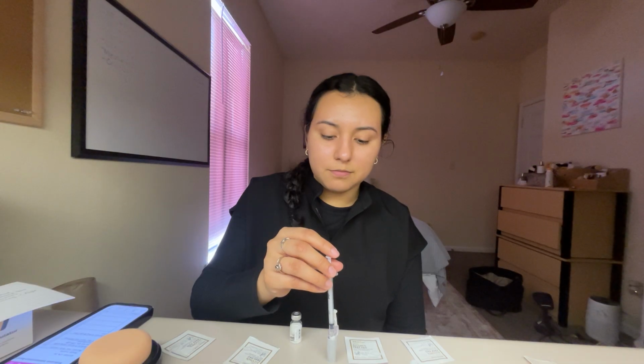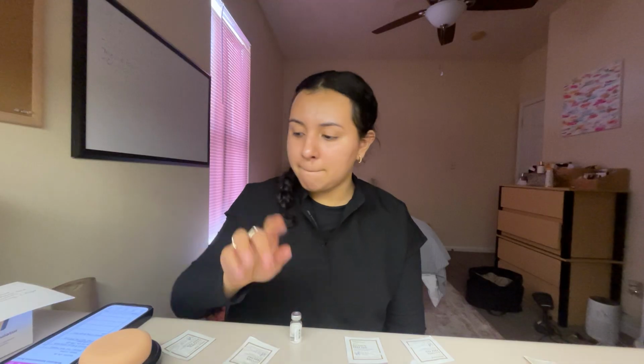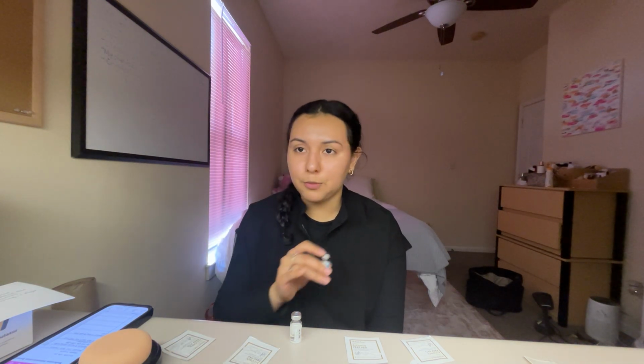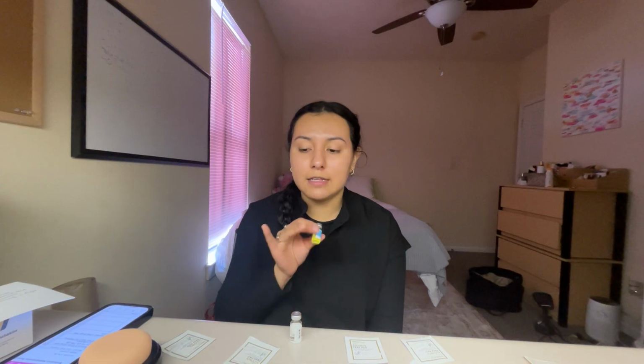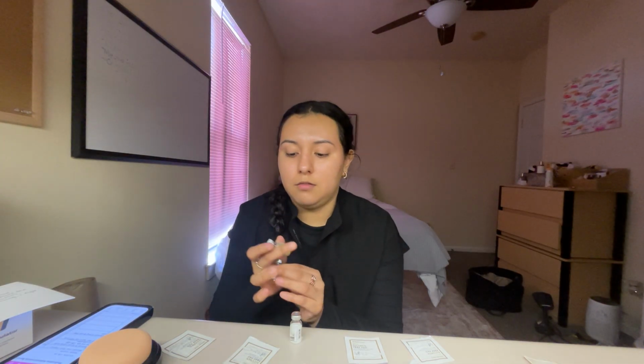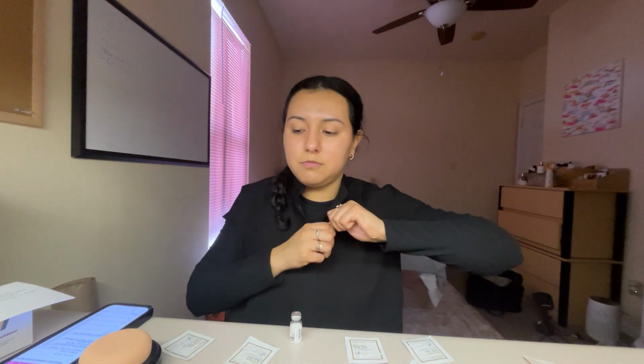Alright, so I'm going to release that, and then again, I'm going to single-handedly cap that. And now for my Demerol, if I didn't have a cap on it, I would do the same thing. I would wipe the alcohol swab on it, and then I would allow that to dry. But if I had one that was closed off like this, I would just remove the cap and reveal the rubber seal. Okay, but since I already have it, actually let me pop this.